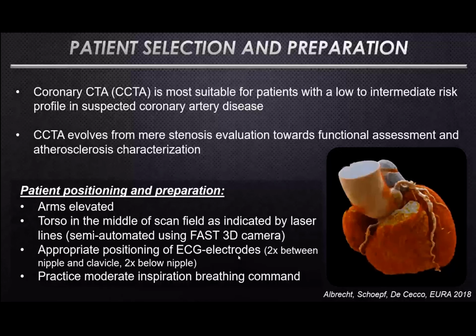When the patient elevates the arms, just test it in advance if the electrodes have really a firm contact to the patient's skin. You may also shave the patient's skin when there's a lot of hair, or you can also use some contact gel, because very often you have ECG problems that are only because of contact problems with the ECG electrode, so you want to avoid that in advance.